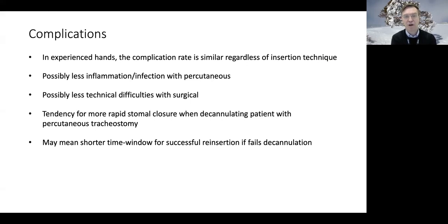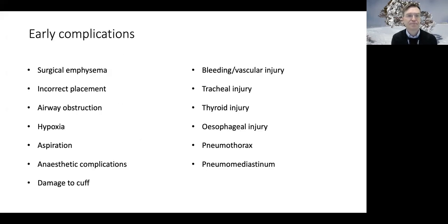My colleagues who are involved with decannulation on the ward tell me that the stoma can close rather more quickly with the percutaneous technique, so that might be something to be aware of, and it provides a shorter time frame for successful reinsertion if the patient fails decannulation. So maybe something to consider at that point.